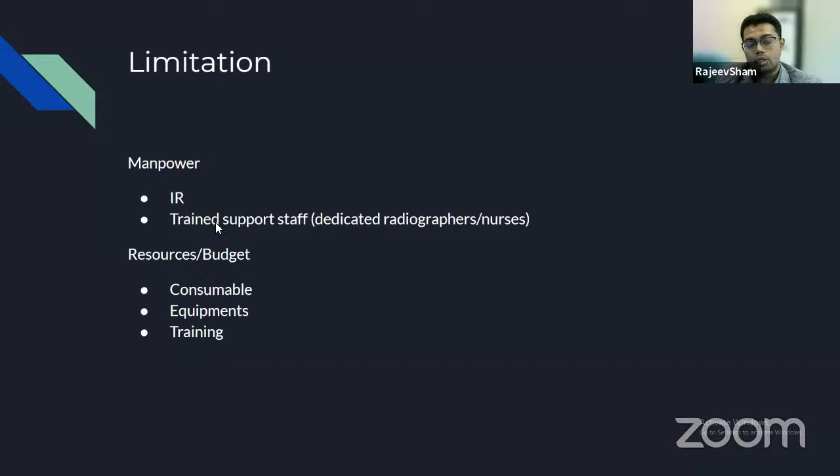We also lack trained support staff, because to do interventional procedures, to handle the angiography machine, the fluoroscopy machine, we need trained radiographers. So they need to be well versed about the machine, the patient position and so on.